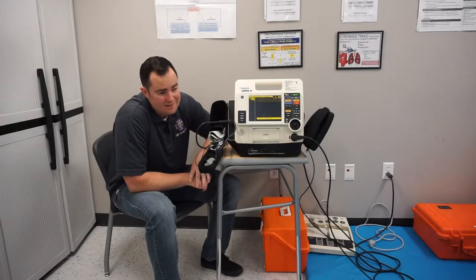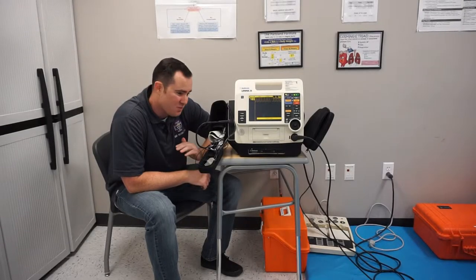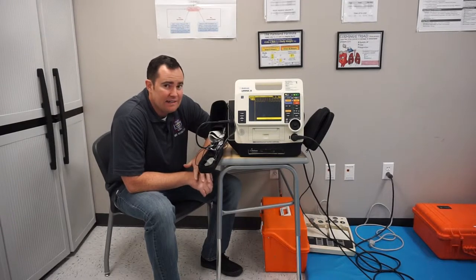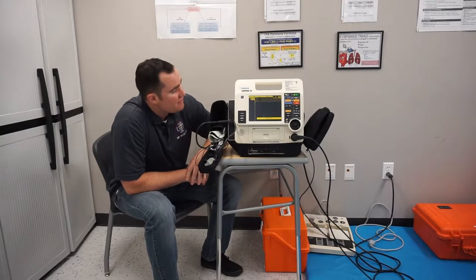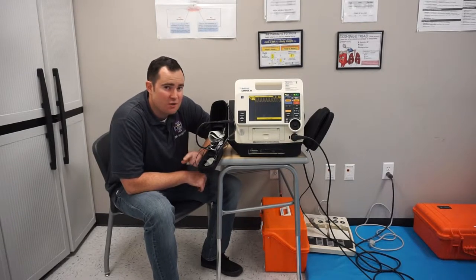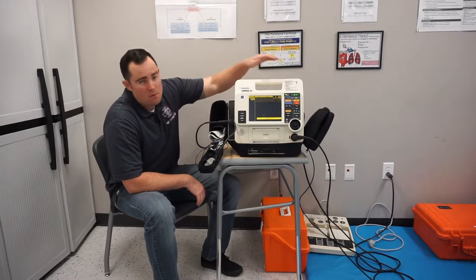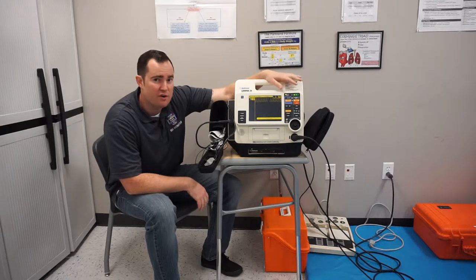You're on a call where the patient's heart rate is really fast — over 150. Here we have a VTAC wide complex tachycardia at a rate of 184. You have determined that this patient is unstable. How are we going to treat it? By utilizing our monitor. Today we're going over synchronized cardioversion.